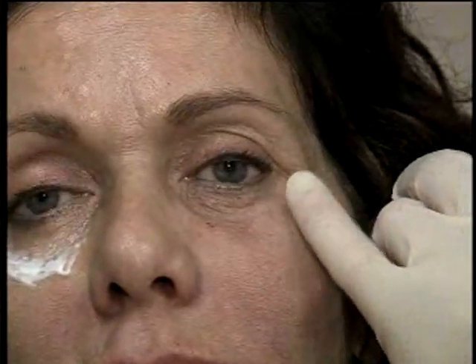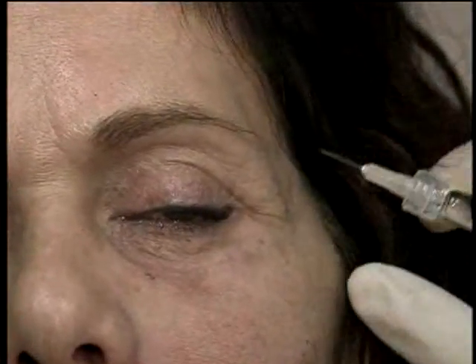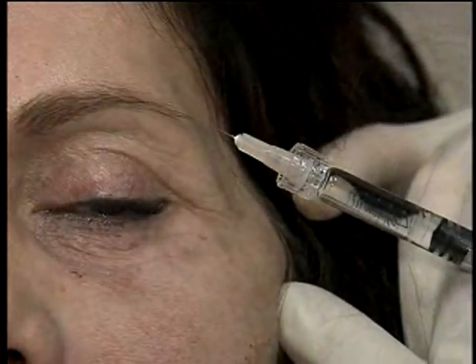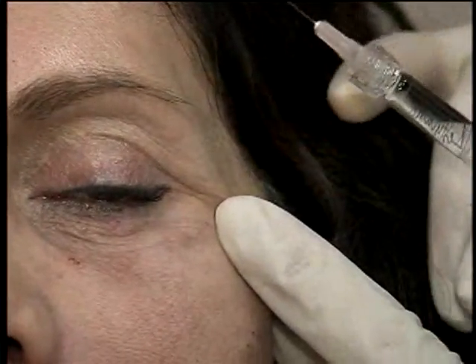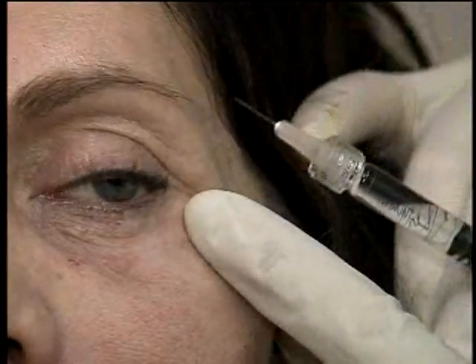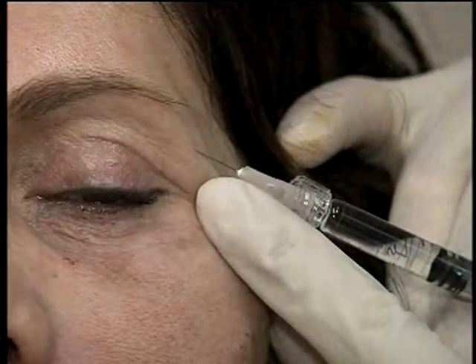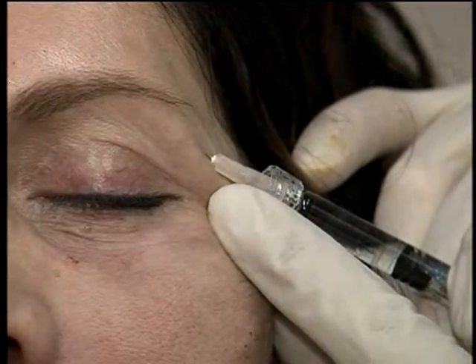Now another area I'll treat is just under the brow here to elevate the lateral temporal brow. One of the ways to do that is I do a threading and fanning technique underneath the lateral brow, and you'll see I'll give it a little bit of an elevation. You could use either Perlane or Restylane in here. Since I already have Restylane in my hand with the 30 gauge needle, we'll go ahead and do that. Underneath the tail of the brow, just deposit a little bit there.